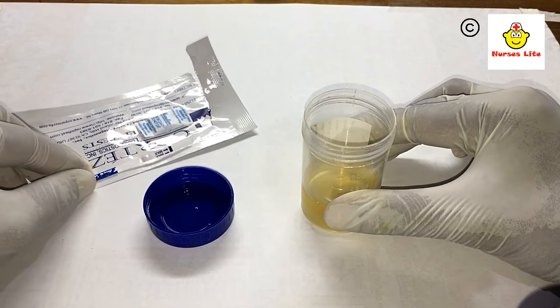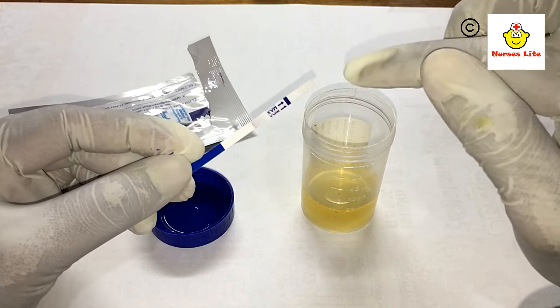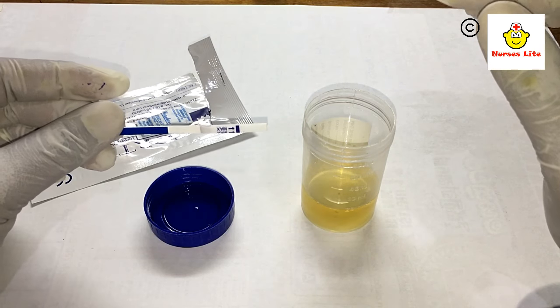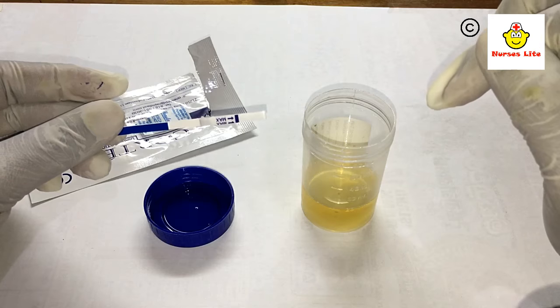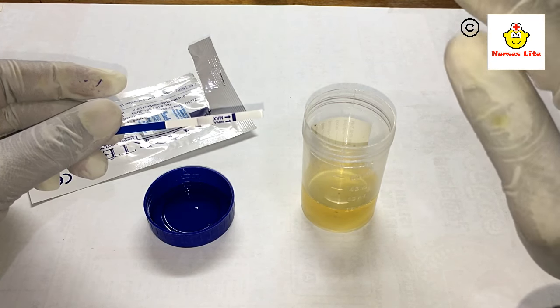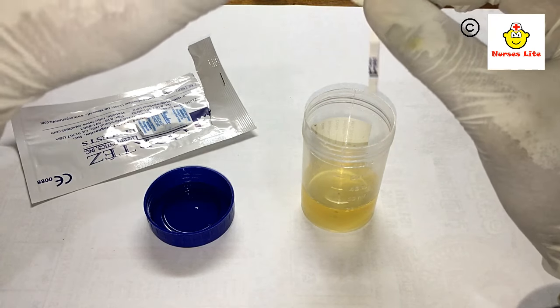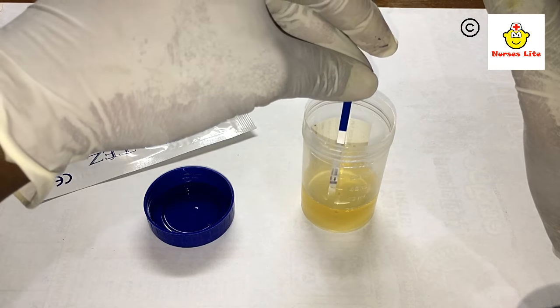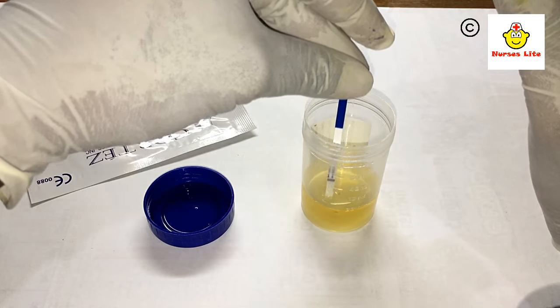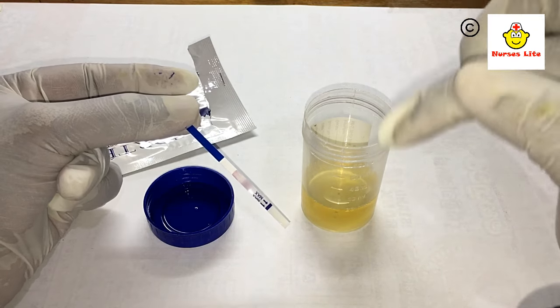To perform the test, dip the stick into the urine for a maximum of five seconds. The results should be read within 10 minutes. After 10 minutes, you should not read the results as it will give a false result. Let's do the test — one, two, three, four, five. Now place it on a paper or flat surface.